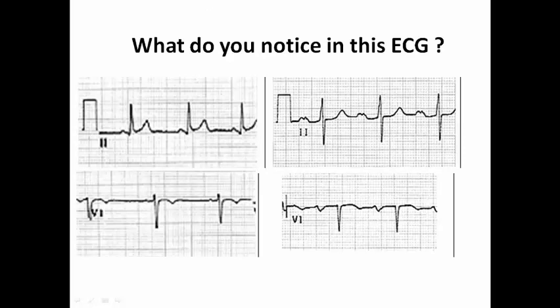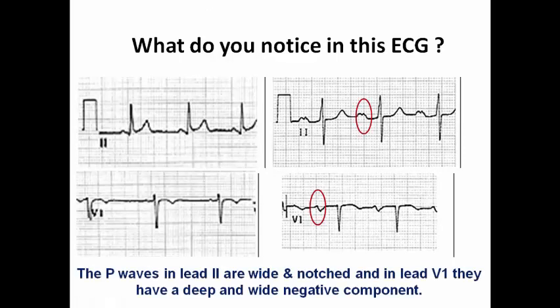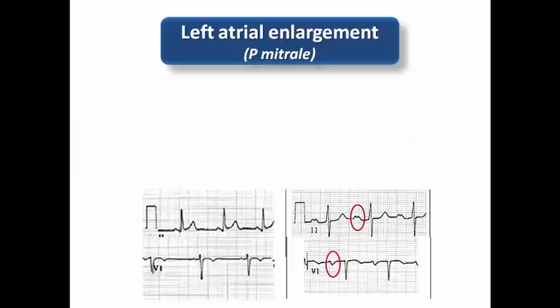Looking at this ECG, the P waves in lead 2 are wide and notched, and in V1 there is a deep and wide negative deflection greater than 1 mm in both duration and depth. This is left atrial enlargement on the surface ECG, compared to the normal ECG shown on the left side of the same image.